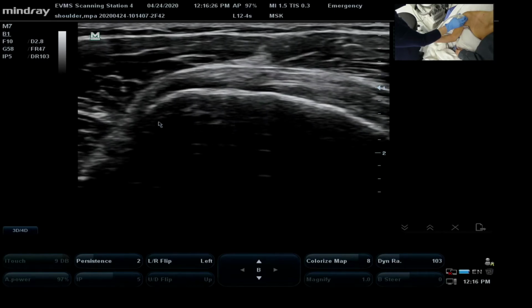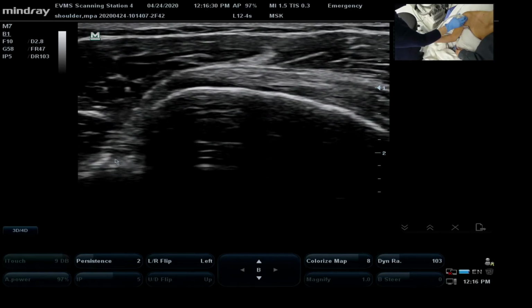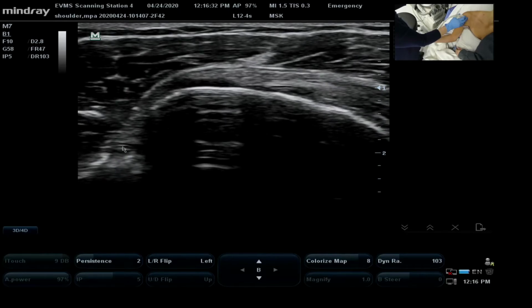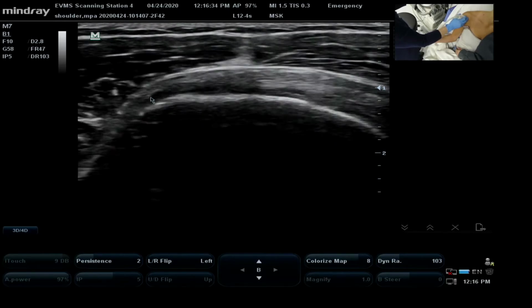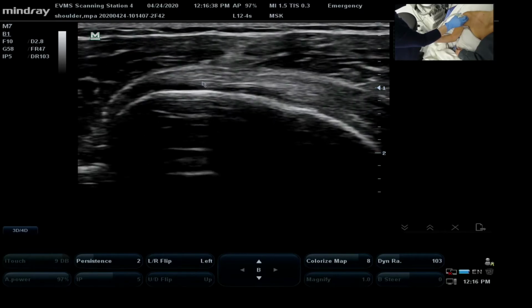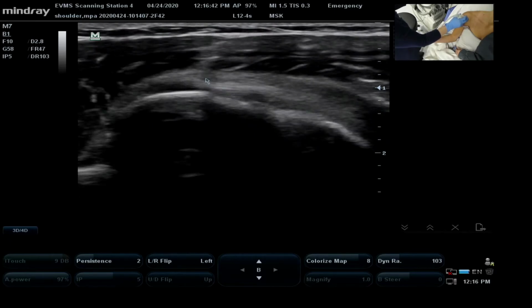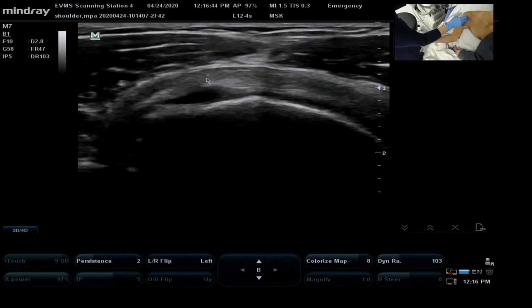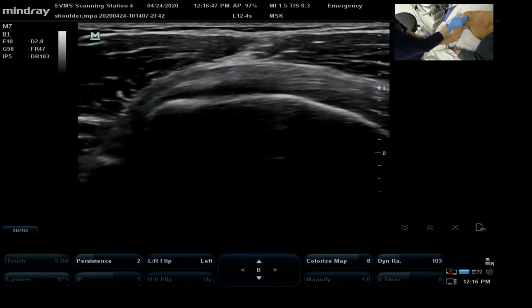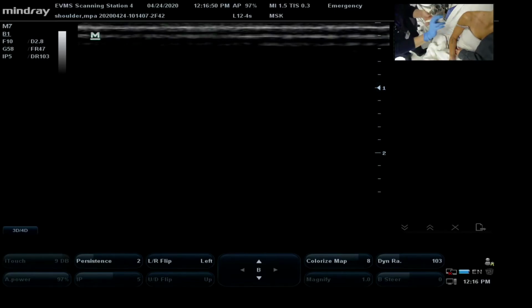And importantly, while she's in that lateral position, the biceps tendon is still sitting in the bicipital groove. So no subluxation, and there was no impingement or bursitis. And we're able to evaluate this tendon as we scan and sweep through it. Okay? And that would be your subscapularis. Let's go back to our slides and talk about our next tendon.